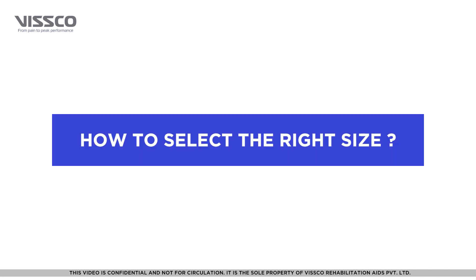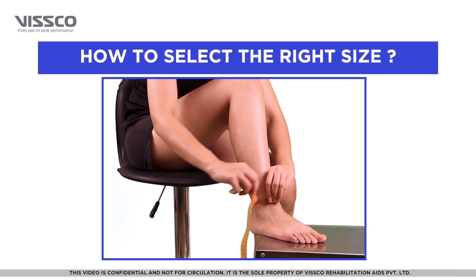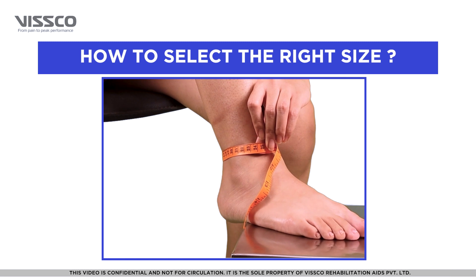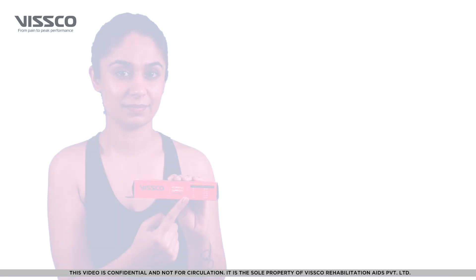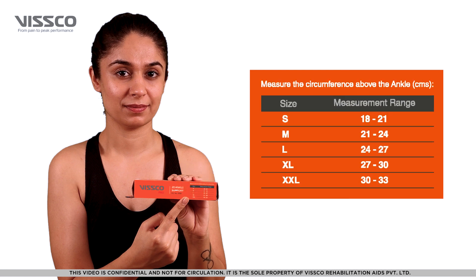For the product to be most effective, it is important to select the right size. Take a measuring tape and measure the circumference around the ankle. You can then select the appropriate size from the chart on the box.